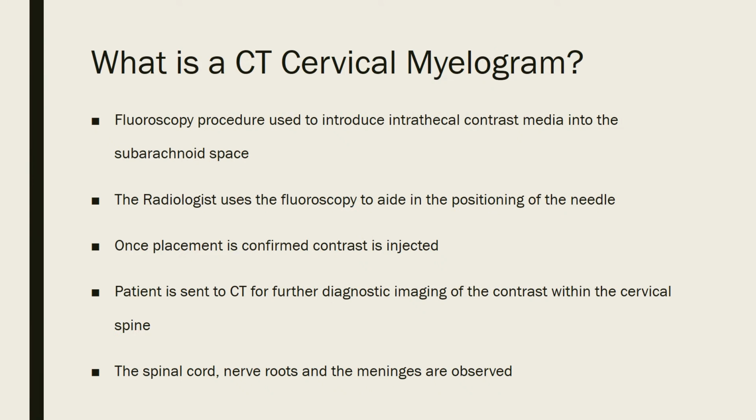For starters, I just wanted to give a brief explanation of what exactly a CT cervical myelogram is and what it entails. A patient undergoing a CT cervical myelogram first starts off in the x-ray department, where they will undergo the fluoroscopy part of the exam.